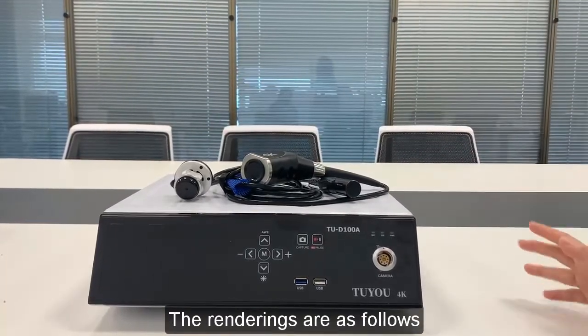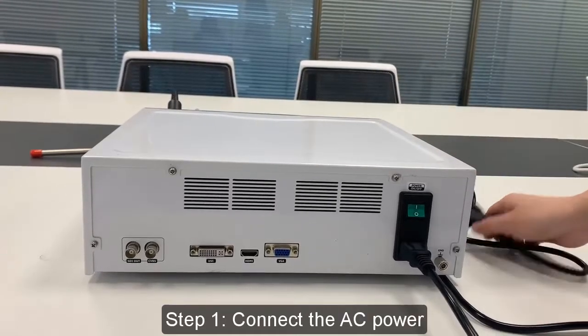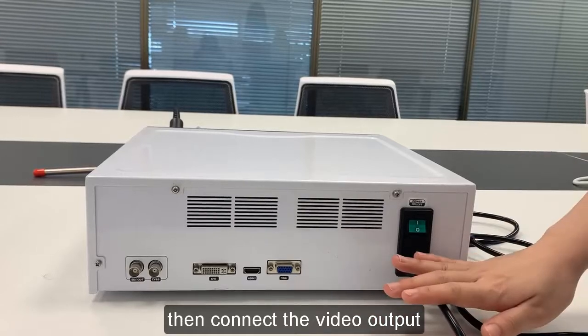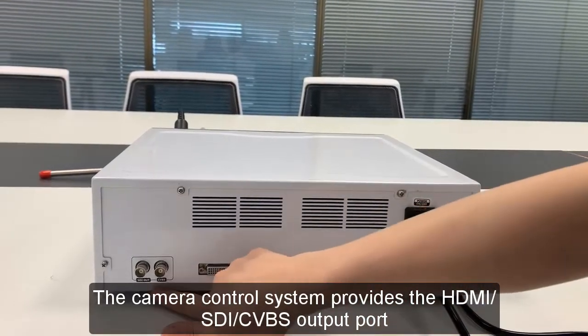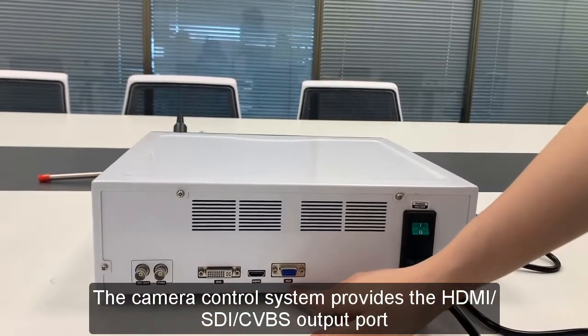The renderings are as follows. Now I will show you how to install it. Step 1: Connect the AC power, then connect the video output. The camera control system provides SDI, CVBS, DVI, HDMI, and VGA output ports.